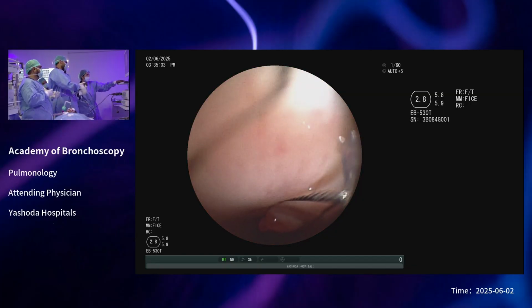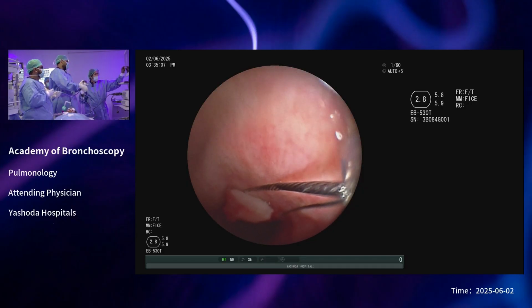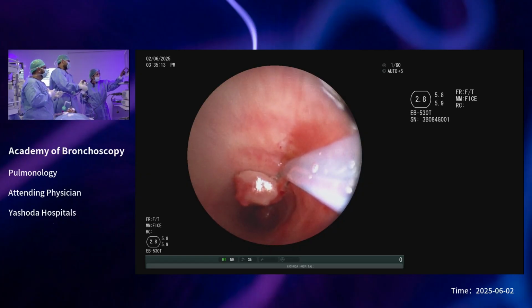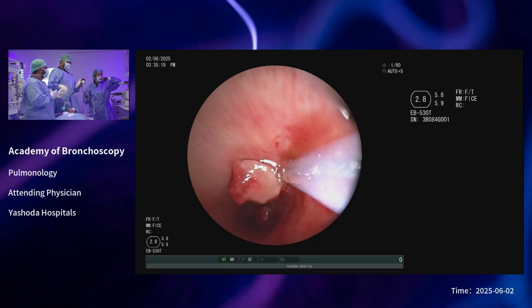That side? Yes. So now what you will do is, now that the snare is around the tumor, push the guide sheath towards the base of the tumor. Little more you have to go close. Slowly close and communicate. When you get resistance, you have to communicate with him.